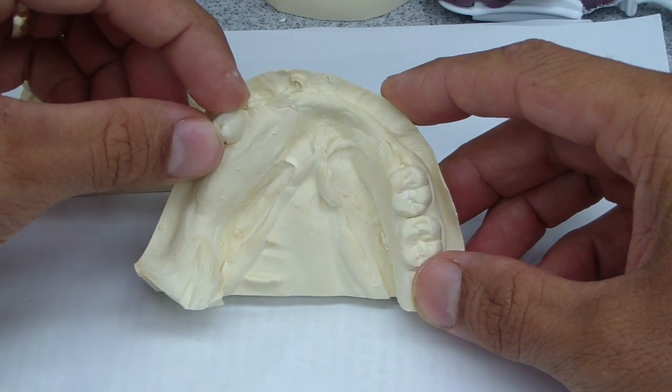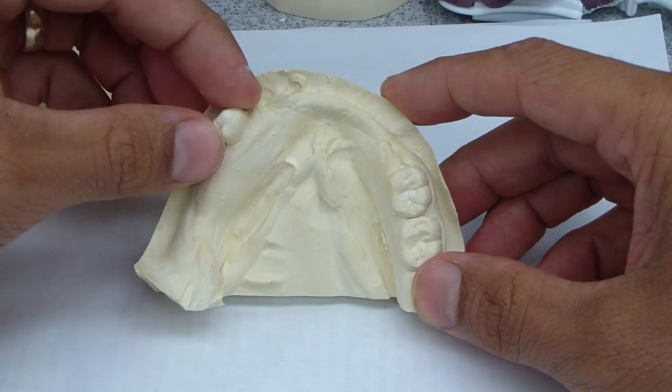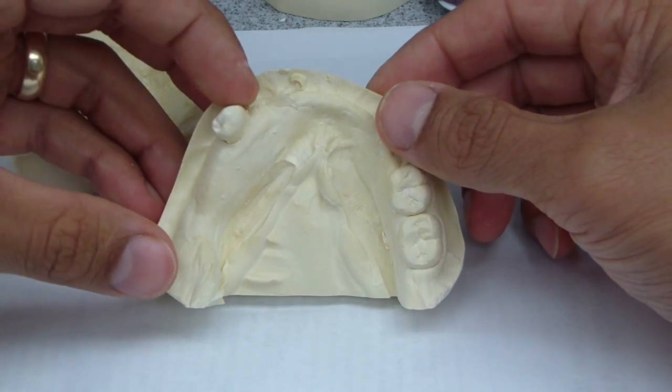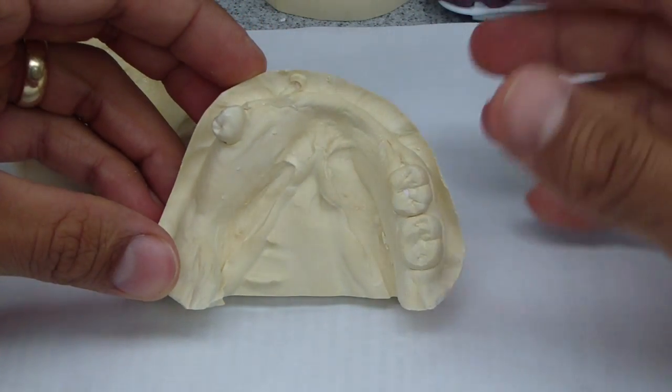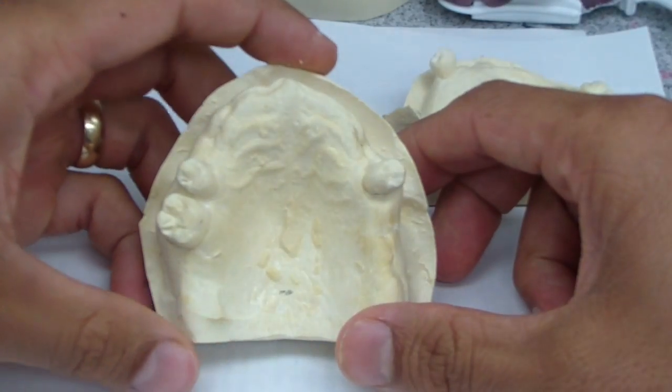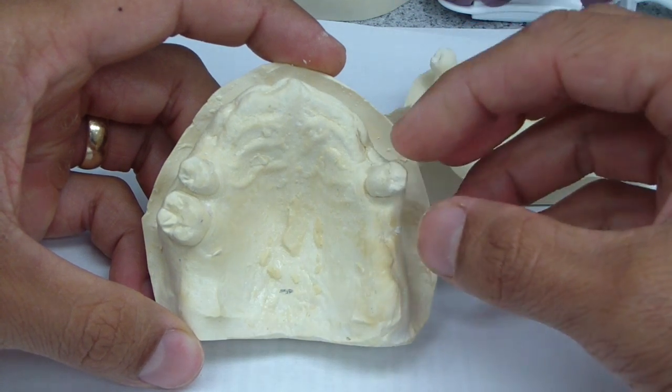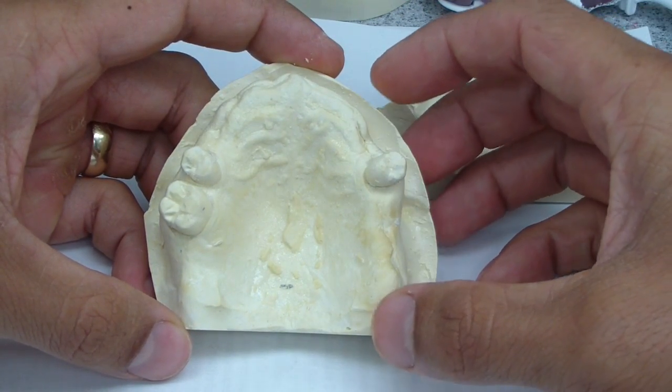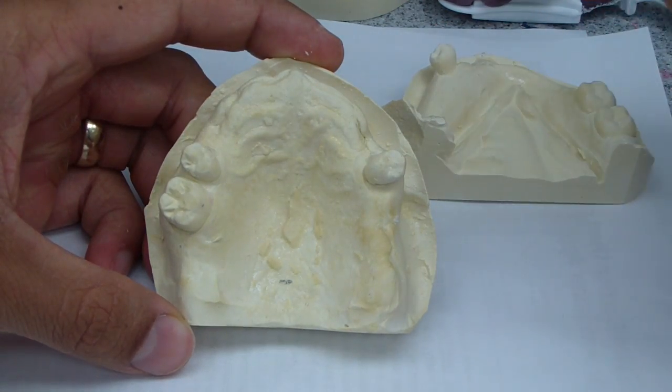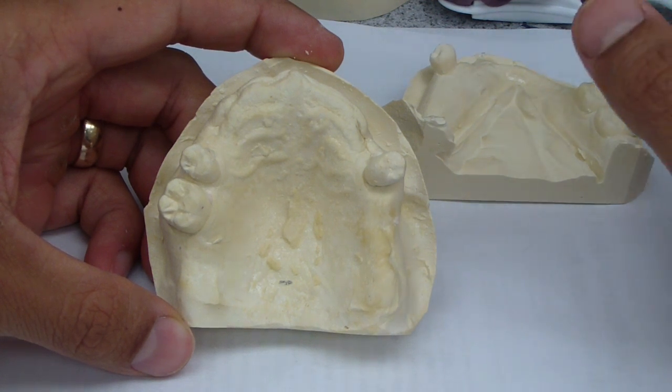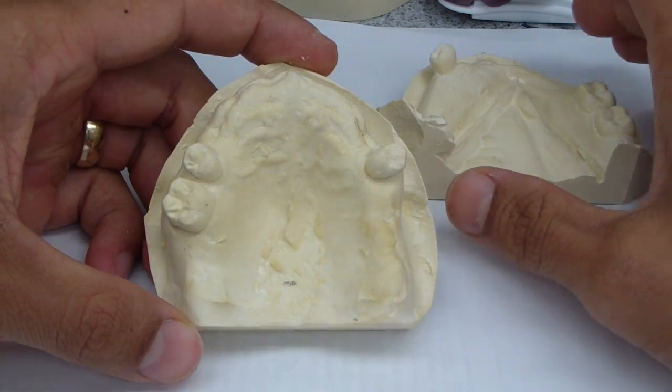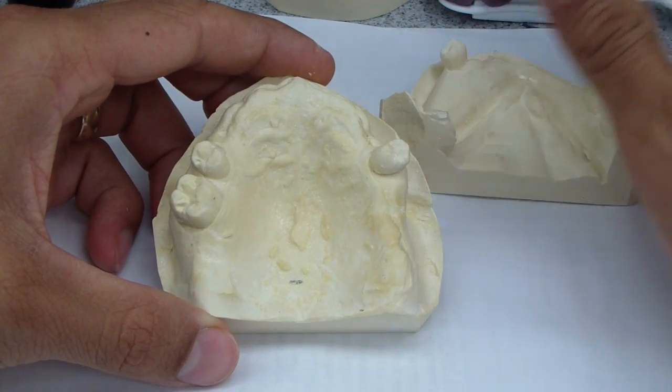The mobility and periodontal status of this bicuspid is fairly questionable, so I think we're going to go down the road of placing a number of implants. Unfortunately I won't be here for that part of the case, however I still am here for this. So what we're going to do is fabricate a maxillary complete denture. This is the diagnostic impression, so in an effort to obtain a more accurate impression of the border flange extensions for its complete denture, we like to do a sectional impression technique.